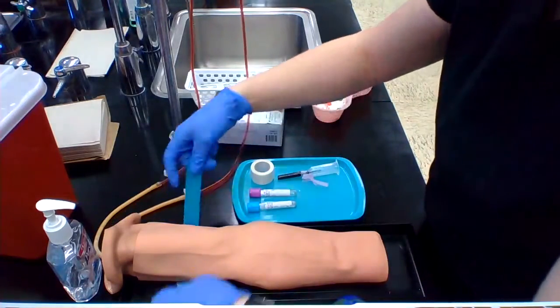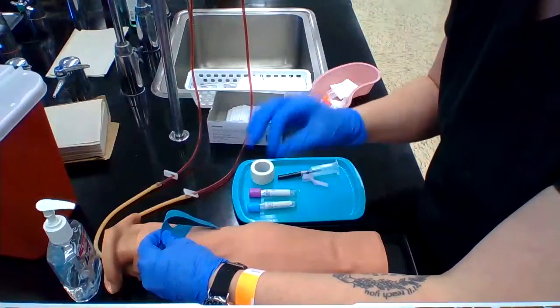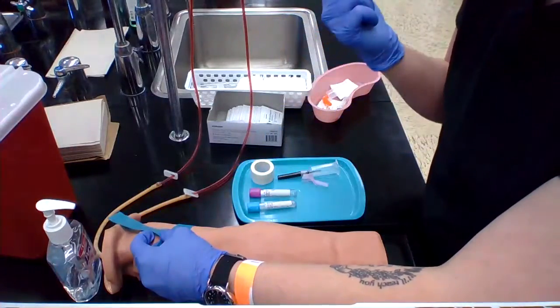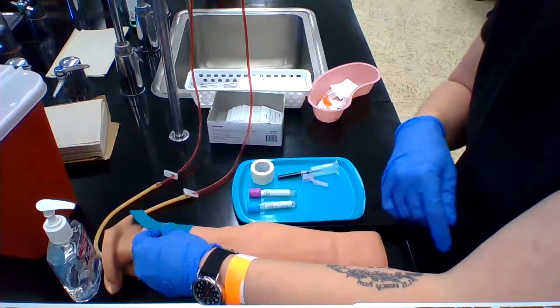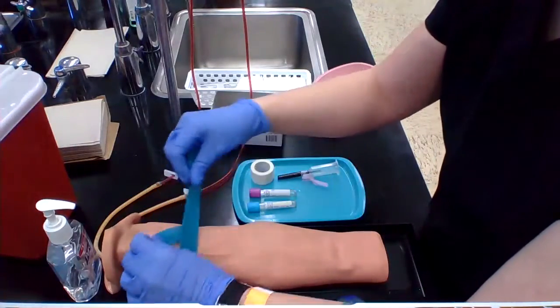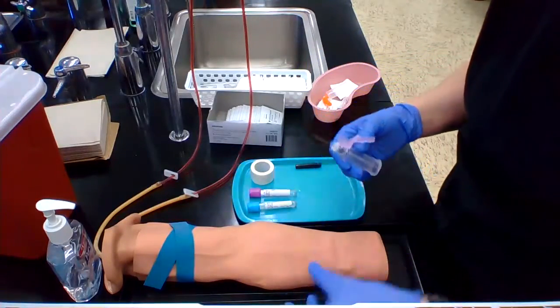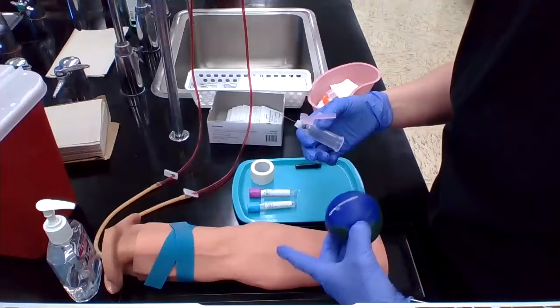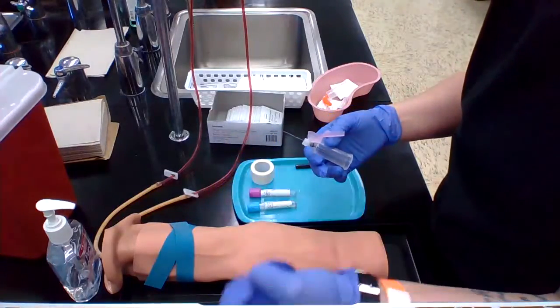I'm going to check with the patient to make sure the site is dry. You don't want to take a blood sample when there's still alcohol drying because it's going to hurt your patient — it'll sting — and if it gets into your sample it can alter test results by altering chemicals in the blood or damaging the cells. Ask your patient if they want a warning; if they do, you can count down from three. If you're having a hard time getting into a vein, you can have them steadily squeeze a ball — you don't want them to pump because that can alter test results.